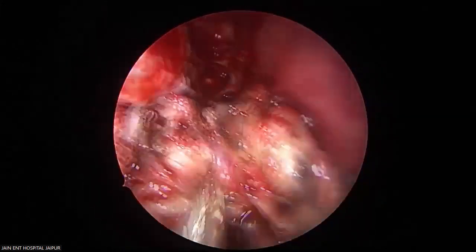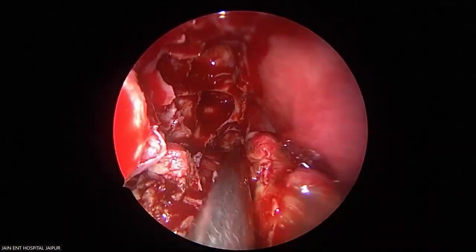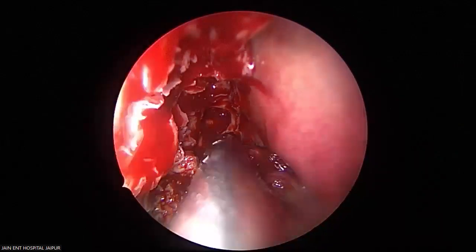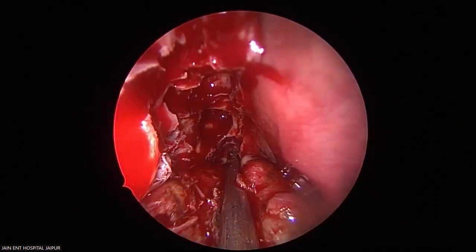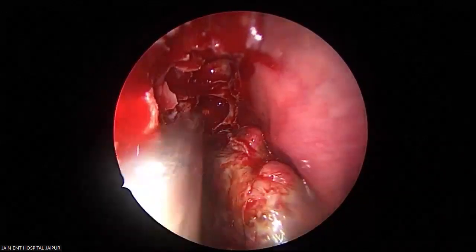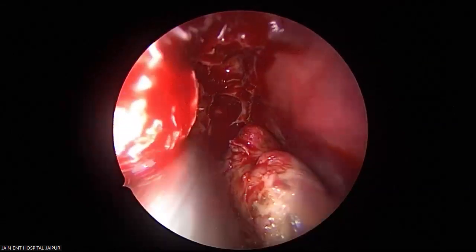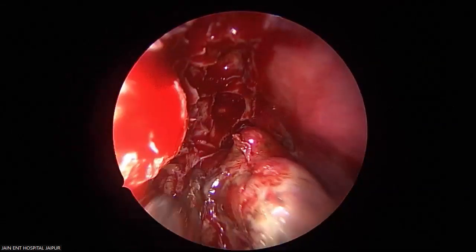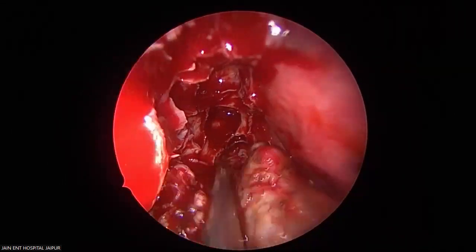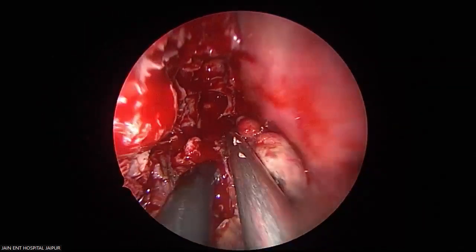So your target now is posterior septectomy? Not now, but now the tumor is exposed. I will coagulate it first. Remove all intervening bone everywhere. See, now I will coagulate this entire surface.